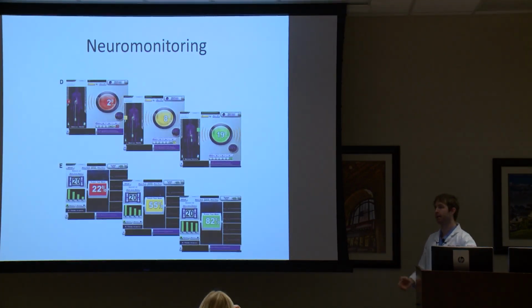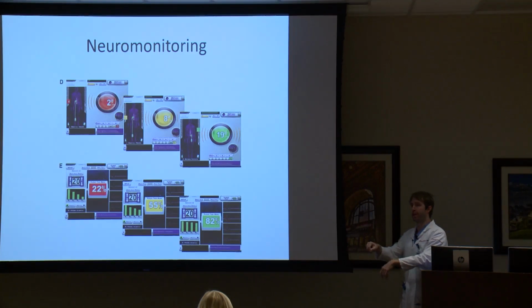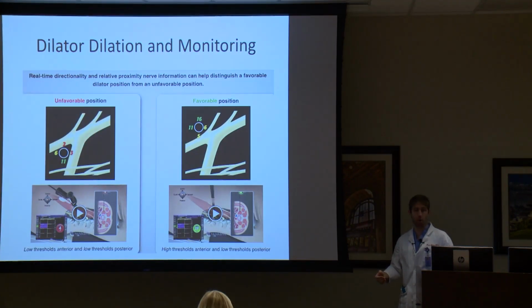Green, all right, we're in a good spot. Yellow, we're pushing a little bit. Red, got to reset. And you can read it yourself, and you take the probe and spin it so you're facing forward, and you say, up, green, facing back, yellow, green, okay, we're safe to go, because you have an idea of where you are based on that. And so they cut out the neuromonitoring folks. The physician does it himself. Now, that little box probably costs an arm and a leg.